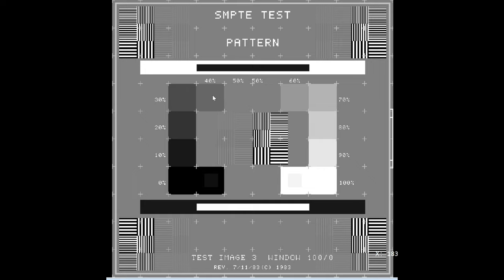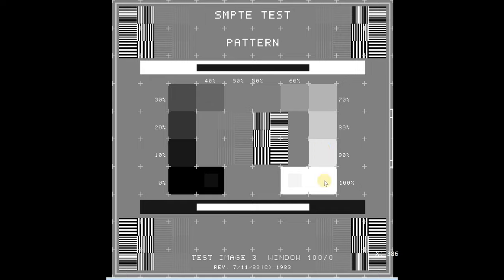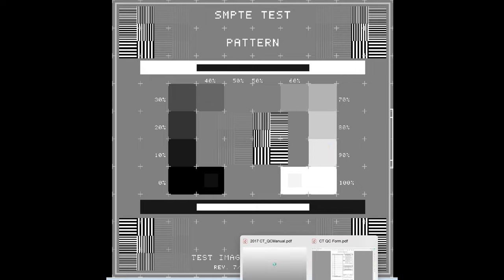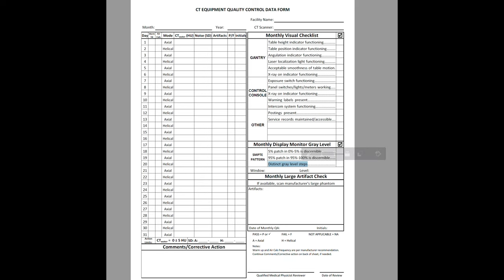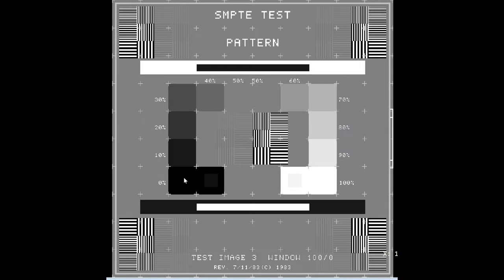30, 40 is here. You have two 50% patches. You have a 60, 70, 80, 90, and 100. So what you're looking for over here on the distinct gray level steps, you're looking to make sure that you can see each one of the gray level steps and that they show as distinctly different colors.